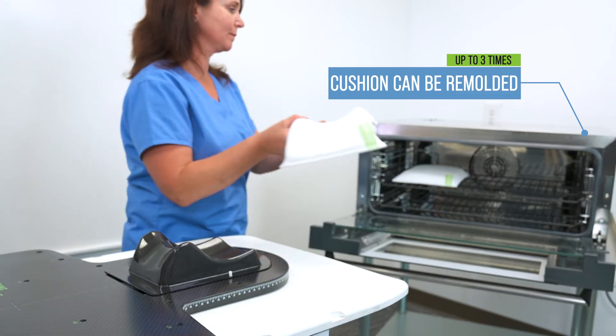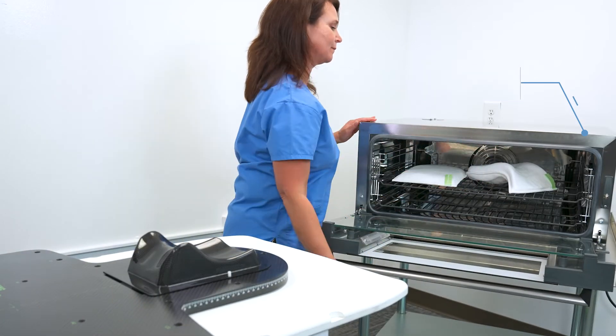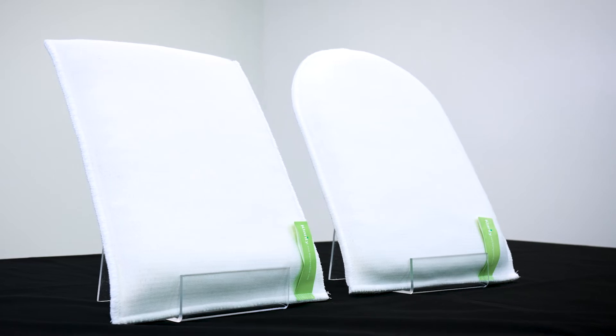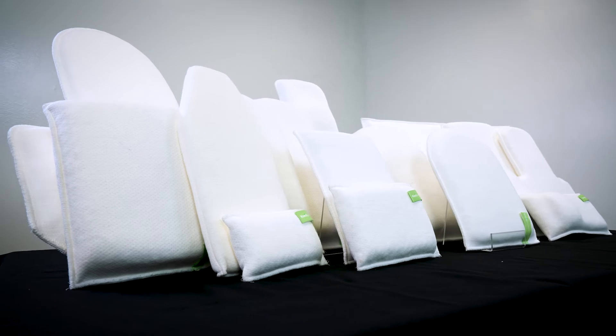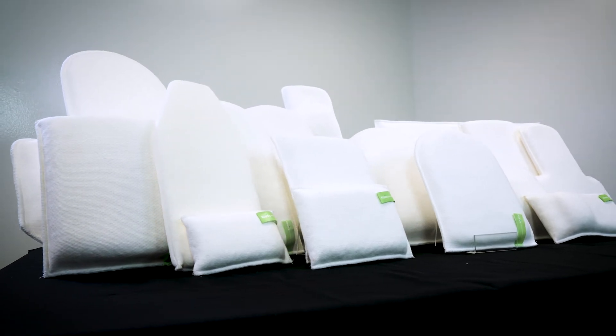Clarity Cushions are available in a nearly infinite variety of shapes and sizes — everything from our best-selling M cushion and U cushion, from smaller to larger sizes, cushions with extra fill in the neck, and even T-shapes for head and shoulder support. Custom cushions are also available. See our full selection and learn more at claritymedical.com.